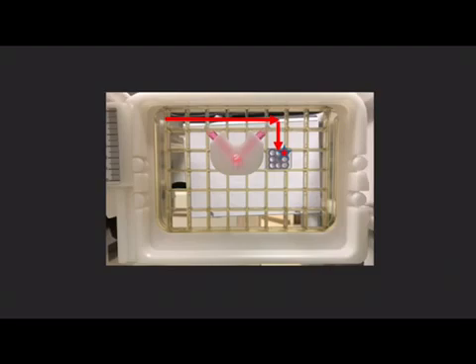I'm just going to very briefly say this is not the same grid positioning as you just saw in the prior image in case you're confused. When we go in, the first thing I'm going to do is confirm that my fiducial is in the square that the technologist told me it was in. In this case, these bunny ears ones only fit in one place, but in other ones they can be placed variably.